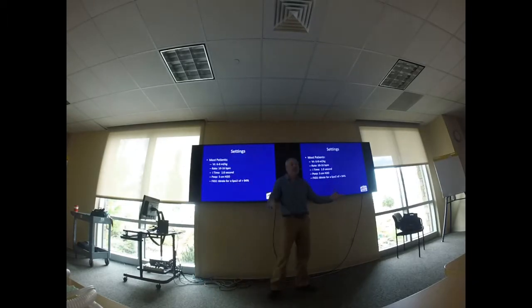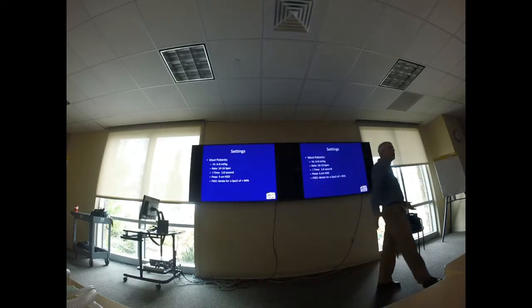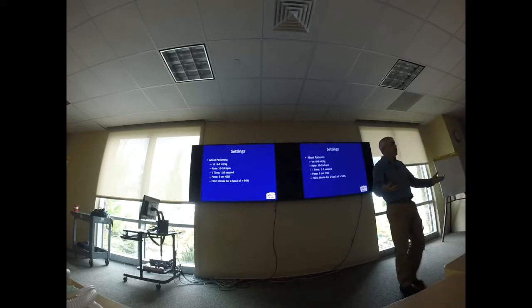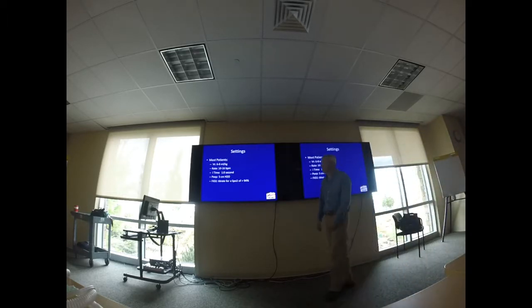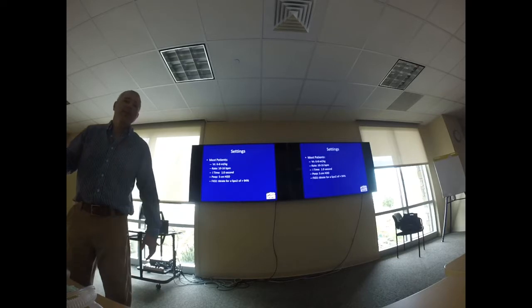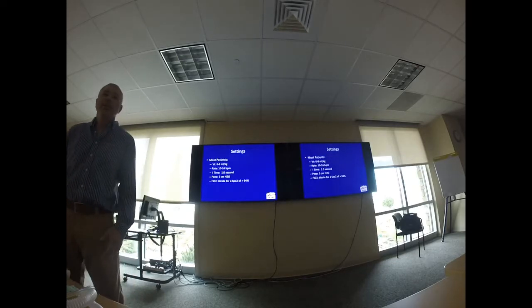So with that 52, what would I do with my ventilator? Would I run it at the same settings? No. What would I do with it? Or what else? Right. And I start with the rate generally. Here's the reason why: I don't want to cause volume trauma to the patient, right? So let's say the volume is at 8 cc's per kilogram. The rate's 12. I'm going to increase it to 14. Okay? Does that make sense to you guys?